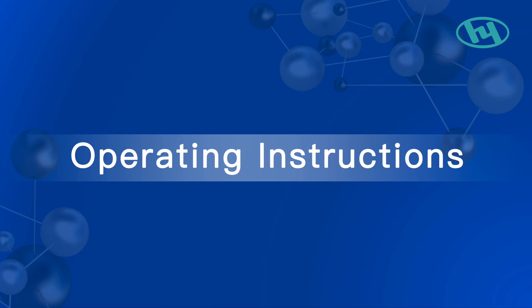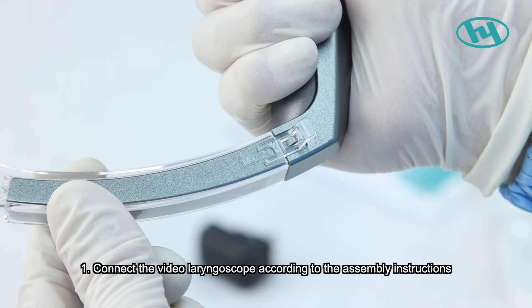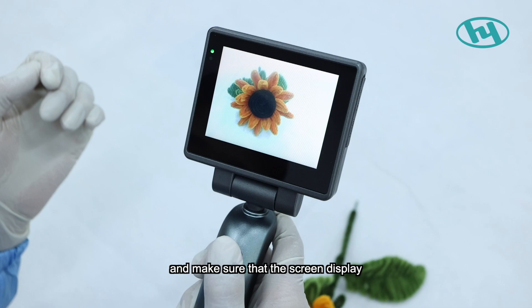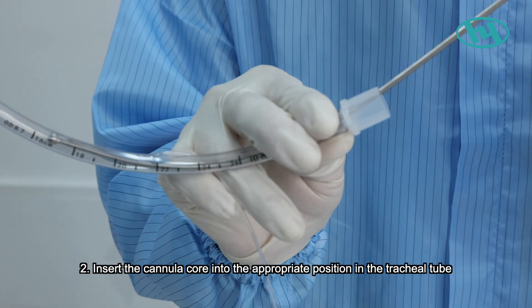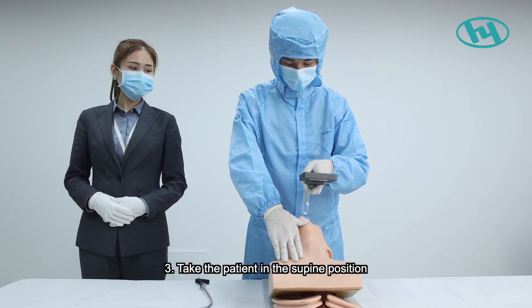Operating instructions: Step one, connect the video laryngoscope according to the assembly instructions, turn on the power switch, and confirm that the screen display and lights are normal. Step two, insert the cannula core into the appropriate position in the tracheal tube.